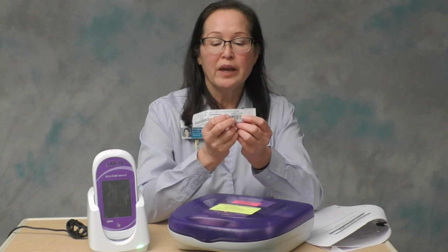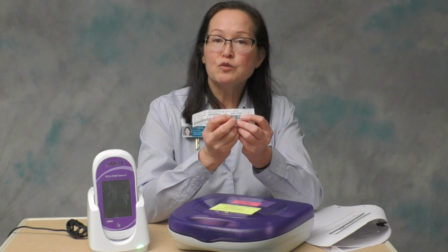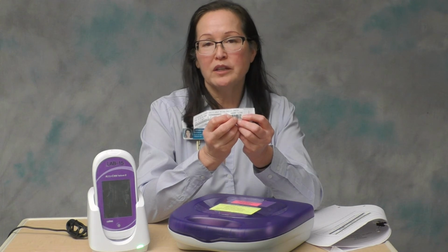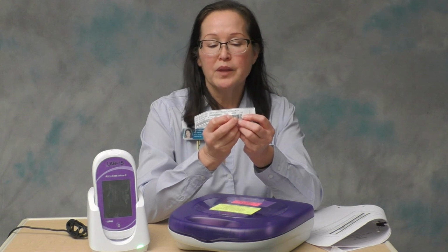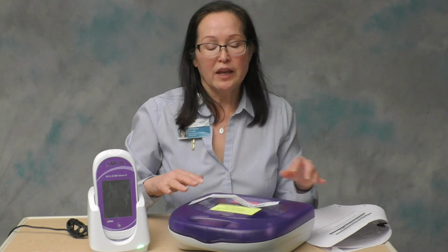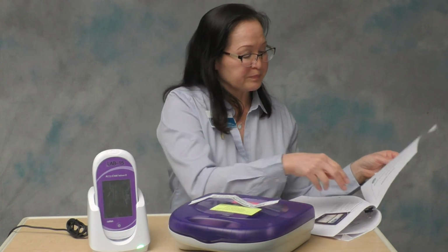This is the only number that you can use for point-of-care testing that will allow the test result to cross directly into the patient's chart in Epic. You are not allowed to manually enter patient ID, and that's a safety feature to prevent typographical error.